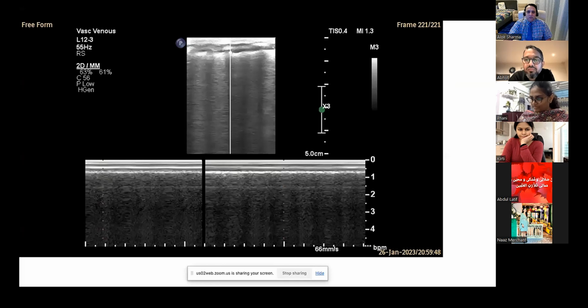What you really want to do is get your focus at the level of the pleura, because you might find that you actually interpret the pleura in a different way in its appearance. And the only other thing is these are lovely compact lines. They're beautiful. So well done.